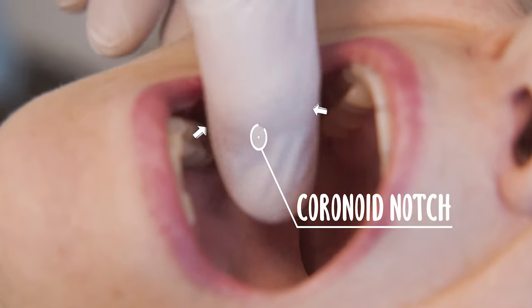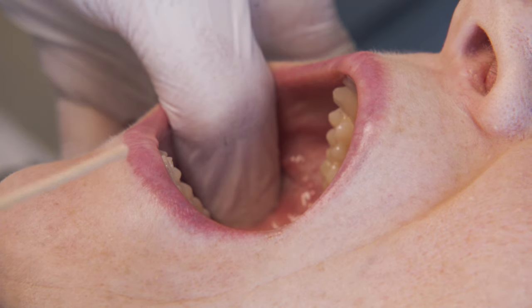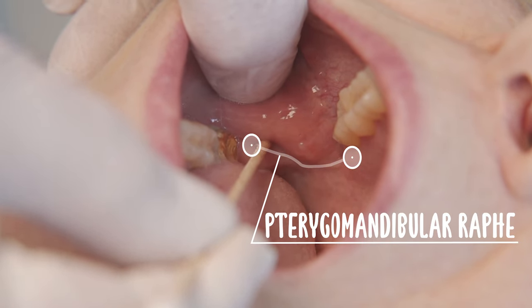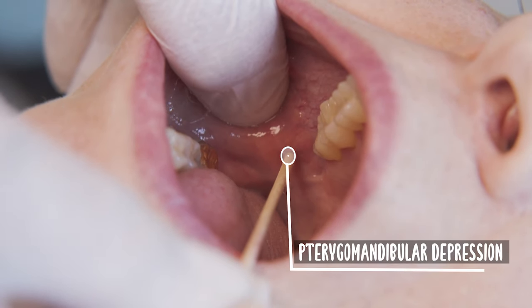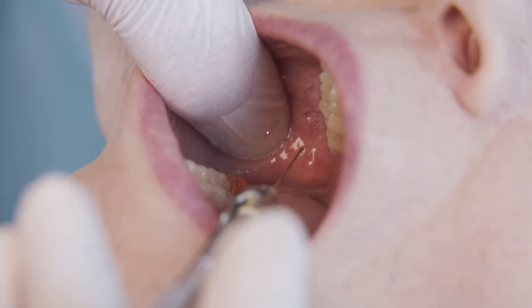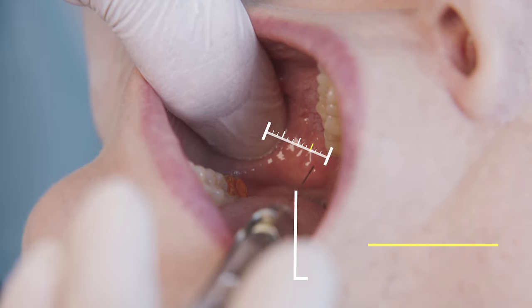With my patient fully supine and the mouth wide open, I place my thumb on the coronoid notch and my fingers on the posterior border of the mandible. So what are the intraoral landmarks? Here's the pterygomandibular raphe. When I pull the buccal mucosa taut, I can identify the pterygomandibular depression. The anterior-posterior insertion point of the needle is located three-quarters of the distance from the coronoid notch to the raphe, within the pterygomandibular depression.